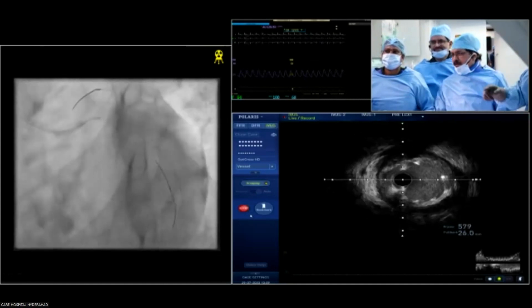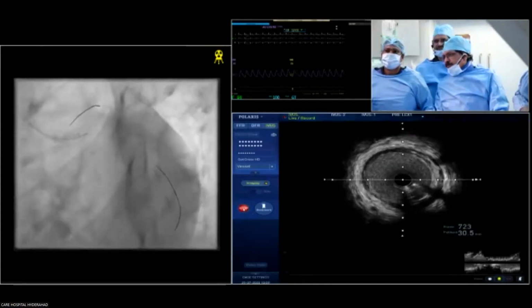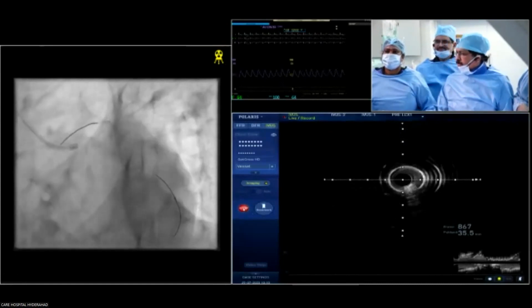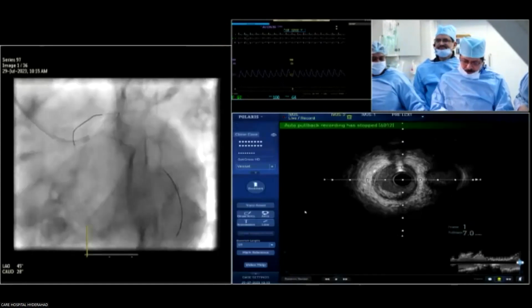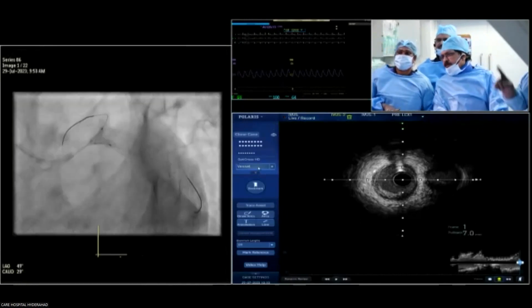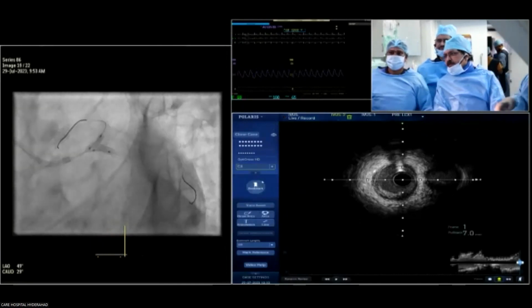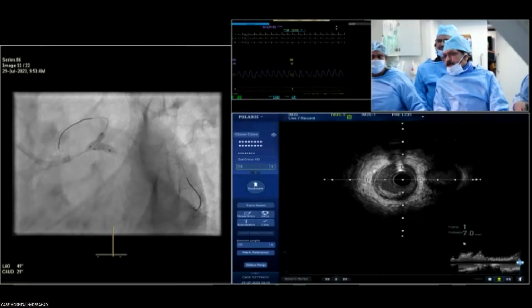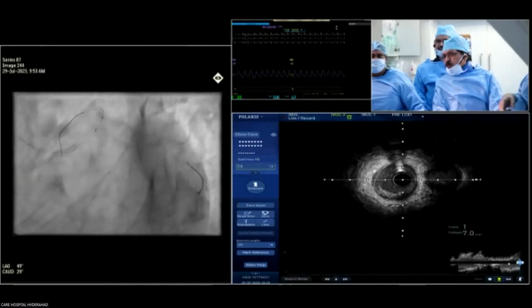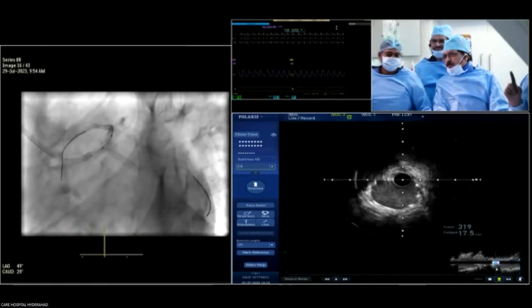Yeah, so still looks like the stent has come back into the left main. You've also got some struts malapposed off of the side of the left main, right? So looking back at that last IVUS, you've got a degree of struts that are coming off of the greater curvature of the left main, and you've got some struts that are coming back towards the distal left main. And so this becomes one of those: do you fully expand the stent, circ back to main, rewire, and just open the struts over the LAD? Or do you try to get a balloon behind the stent, crush it, and then turn it into a formal bifurcation? Right? I think that's where we are.